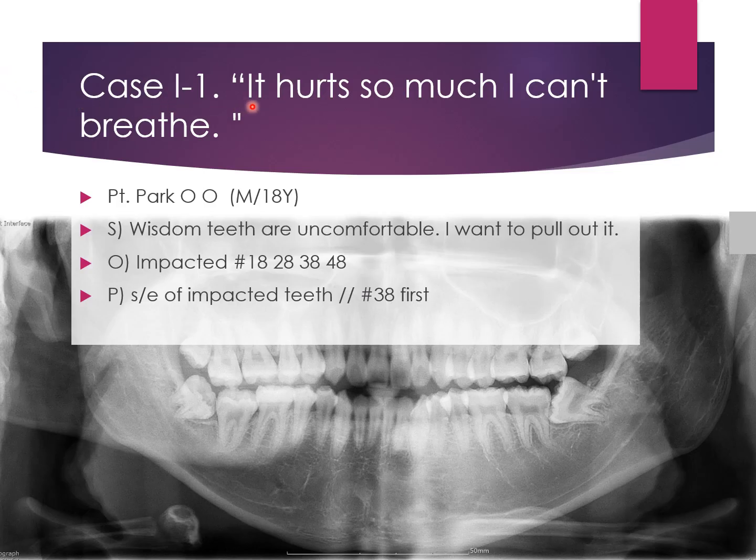The first case is, it hurts so much I can't breathe. He was an 18-year-old male patient, and he came to our residence because he was uncomfortable with his lower wisdom teeth and wanted to have it extracted. Looking at this x-ray, it doesn't seem that difficult, right? Besides, it's a young patient. So our resident proceeded with local anesthesia first to pick it up.